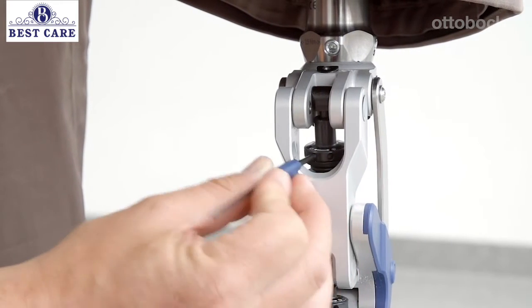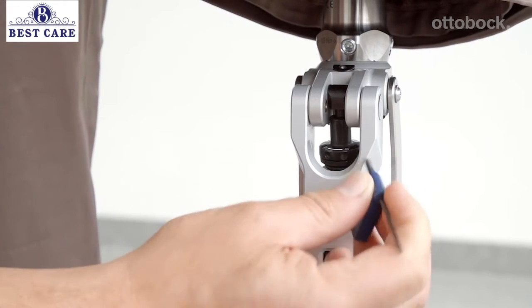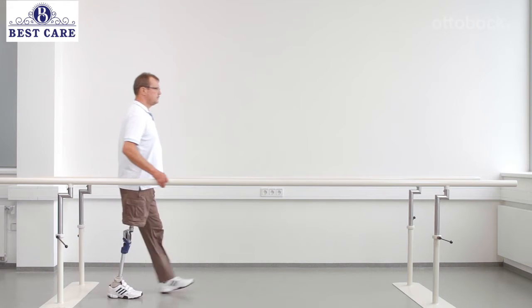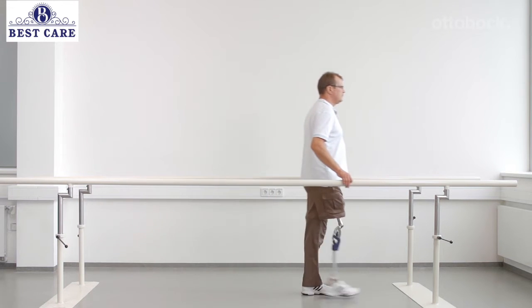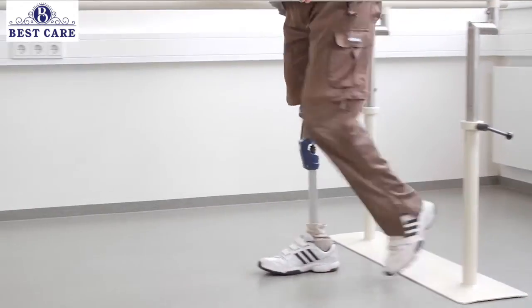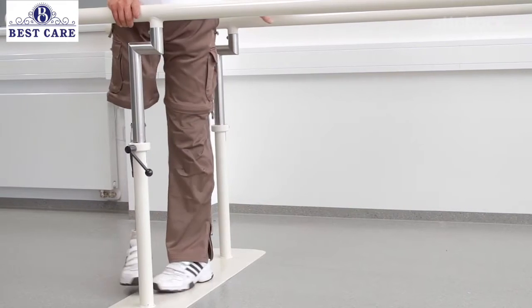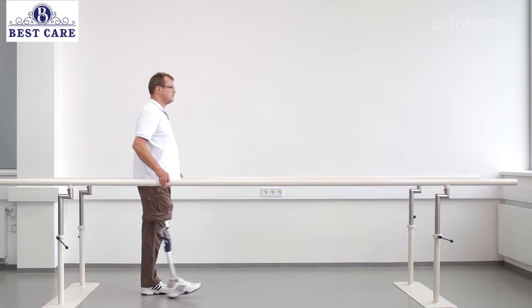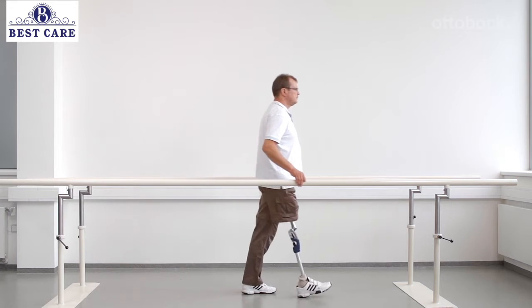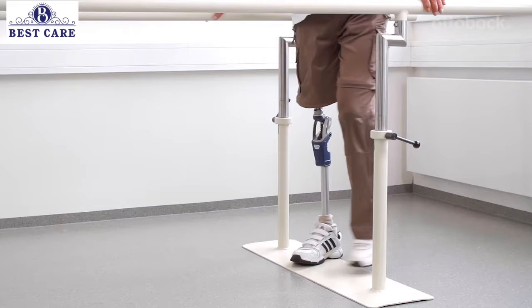Now tighten the extension spring slightly. Make sure that the prosthetic knee is in full extension when the prosthesis is loaded during heel strike. Once the optimal setting for the user is found, it's time to walk at a self-selected walking speed. Walking at different gait speeds is necessary to confirm that the swing phase is set optimally for the user. The settings should be comfortable for the self-selected walking speed, and should still be safe for changes in walking speed.